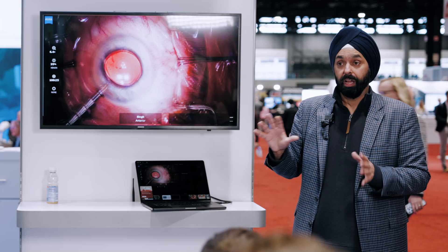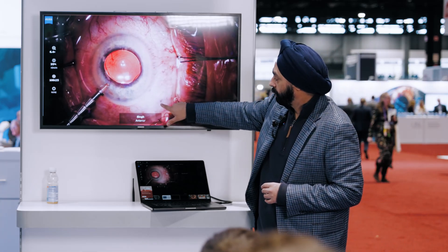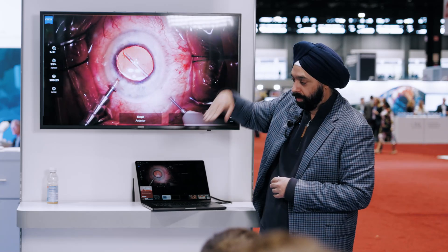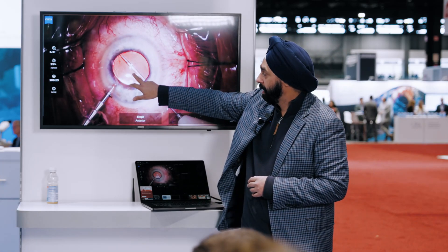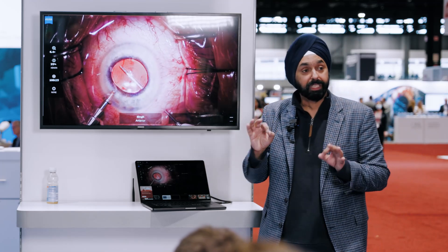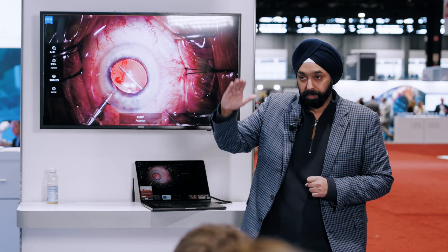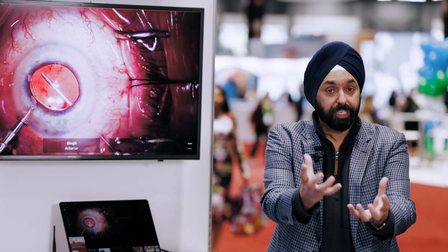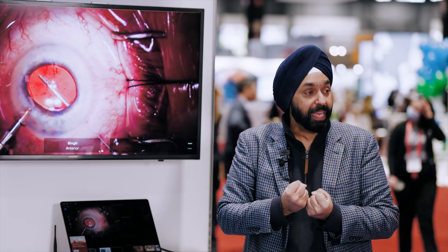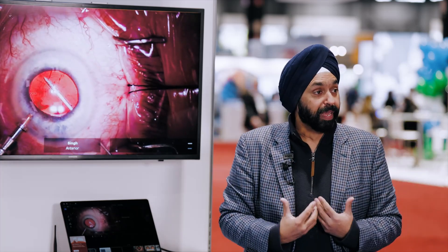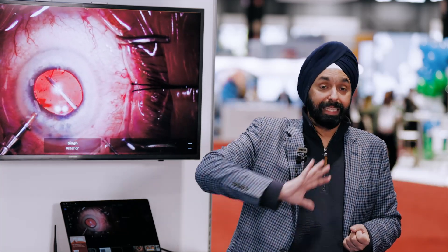This is actually one of my first cases ever. Enter about three and a half millimeters behind the limbus, going right towards the middle of the eye, then go just underneath the lens — towards the middle, then aim up. I'm now behind the lens, not touching the capsule but just behind it where I can see it. Now apply vacuum, but here's the key: keep the vacuum under a hundred or so. The goal of this procedure is not to pull vitreous away from the base of the retina — we only want to remove whatever is liquefied and floating around.